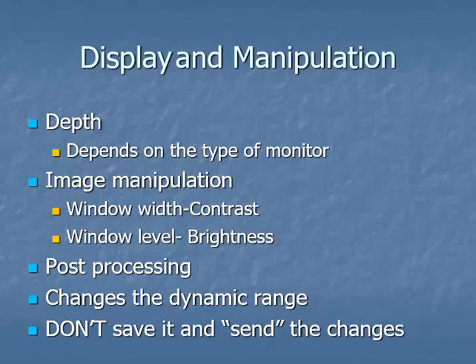So in image manipulation and display, you've got a lot of things to consider as well. The depth of the image and the number of grayscales that your monitor will display is probably going to be significantly lower than the radiologist's.